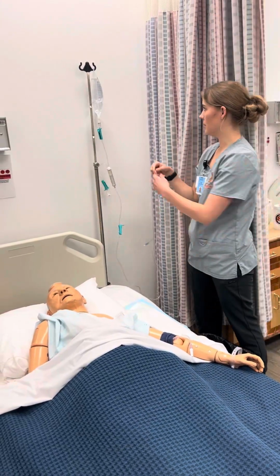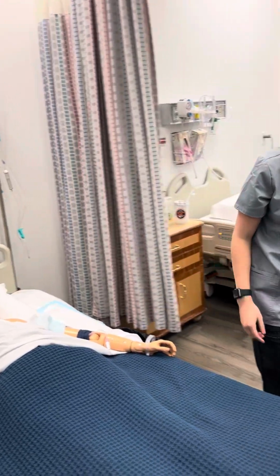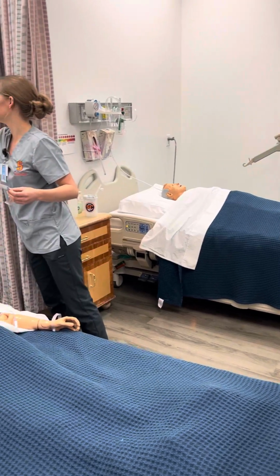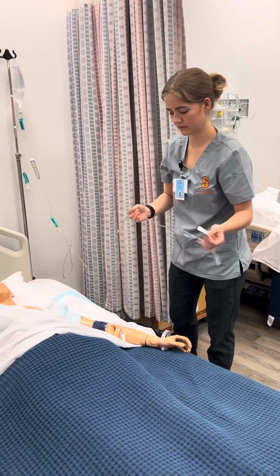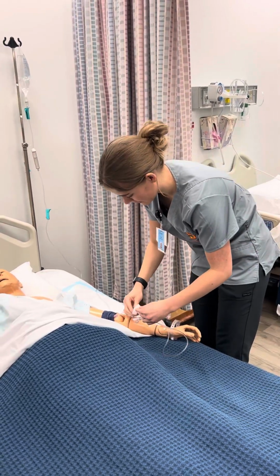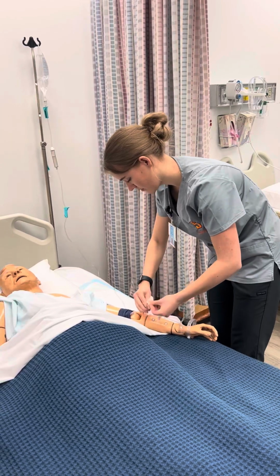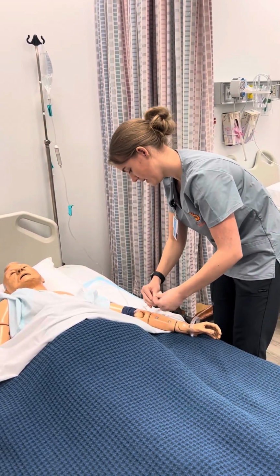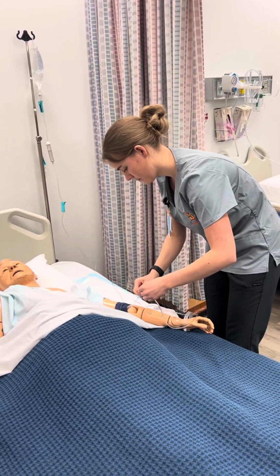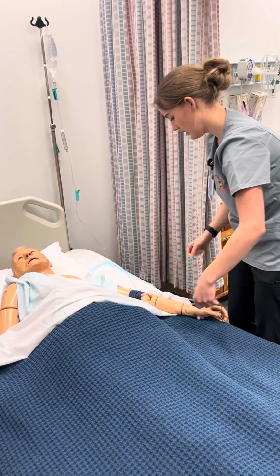Okay, now that that's all primed, I'm gonna go ahead and just connect it to my patient. Clean the thing really good. I'm just gonna make sure to clean this for a solid 30 seconds and just scrub vigorously. Okay, 30 seconds later. I'm just gonna attach this to me for a second. Okay, and all that's still clamped.